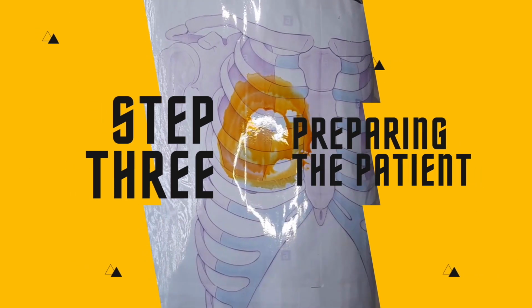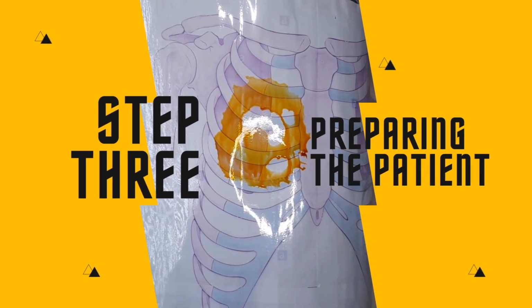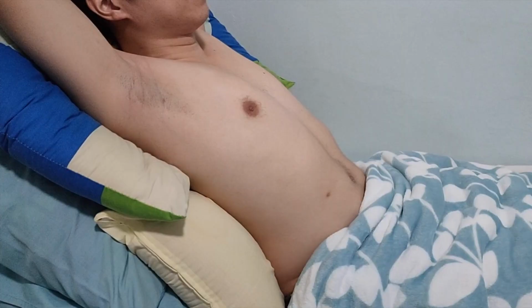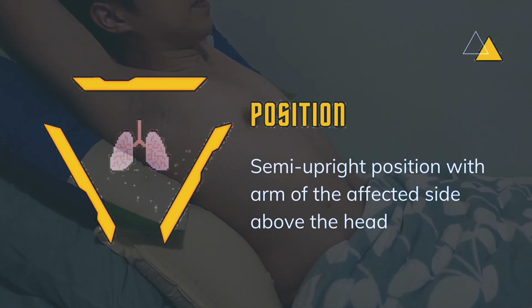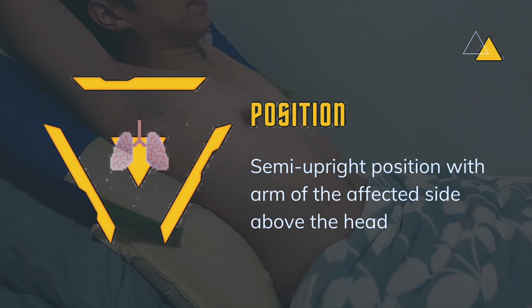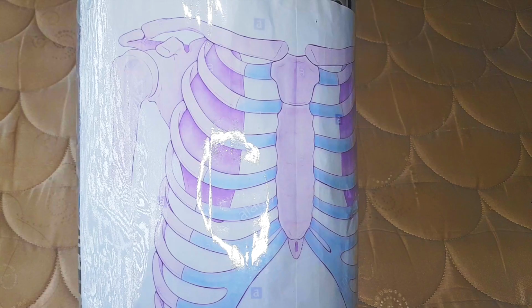Step 3. Preparing the patient. Position the patient in a semi-upright position with arm of the affected side above the head. Clean the skin surface with povidone iodine, making sure to cover a wide area of chest wall. Do this step 3 times.